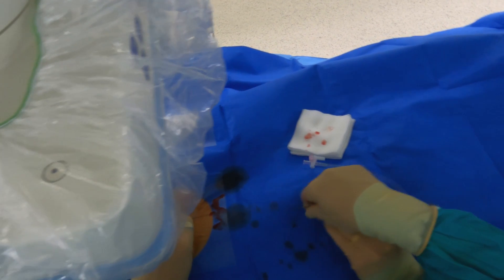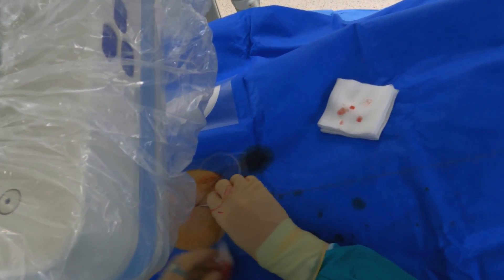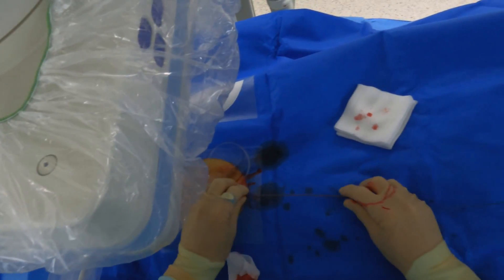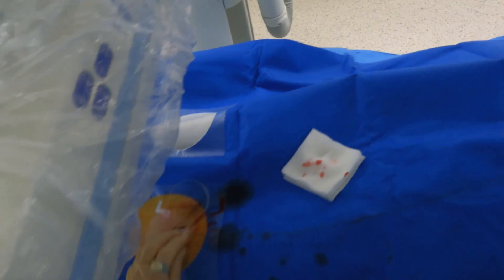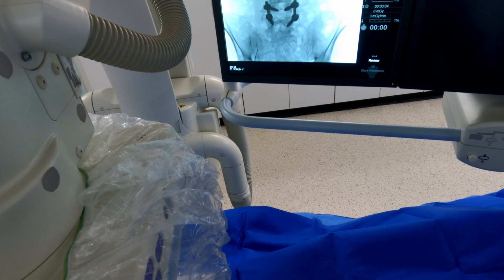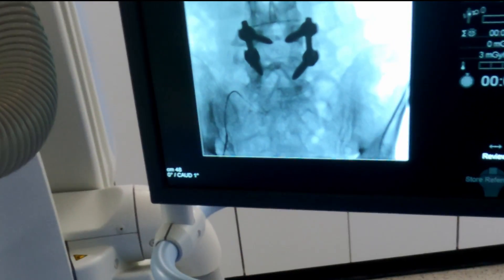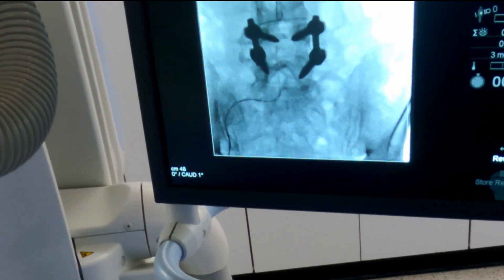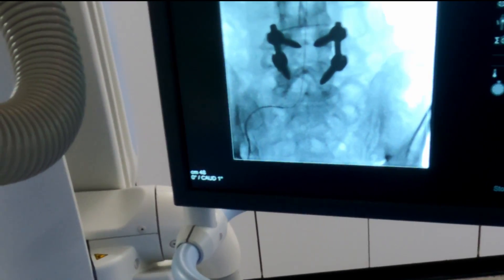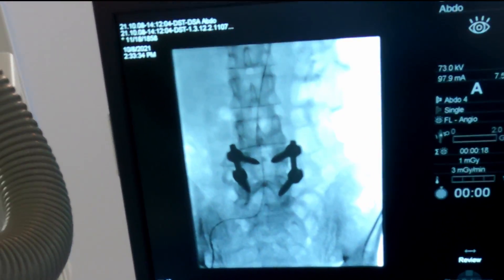We're going to start with a standard five French sheath and then use a four French cobra — it's a small fine catheter with a good shape to get into the renal artery, providing the renal artery is not down-sloping too much. If it is, I would use a sidewinder or a SIM 2. We've got tortuous iliac arteries here, so we're just taking the catheter up and advancing the standard J wire straight up the aorta. Now I'm just going to take the cobra up.